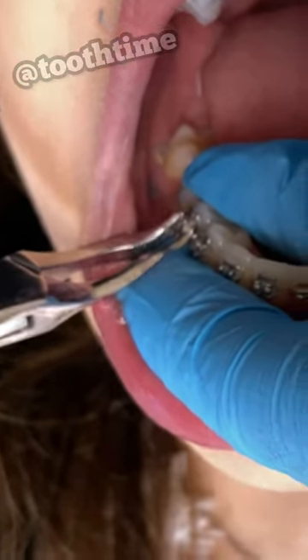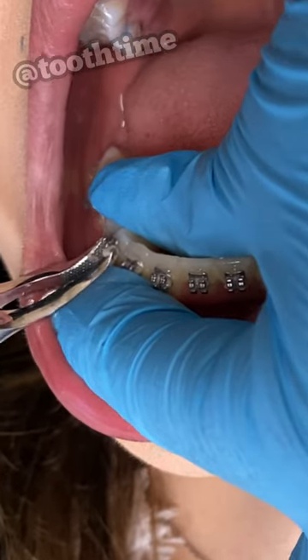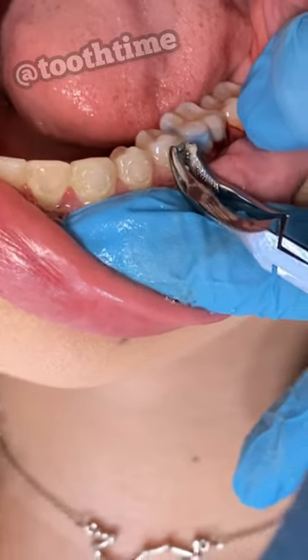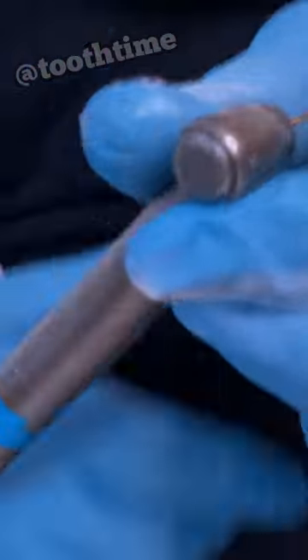Sometimes we take off the brackets one by one, or with the wire entirely — it just depends on the patient. Sometimes it's a little bit sensitive, but not too bad, as you can see here.